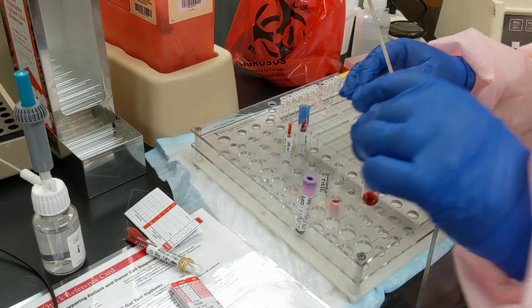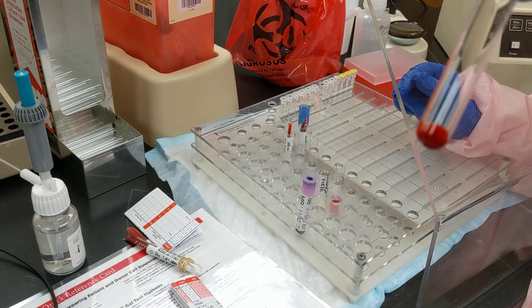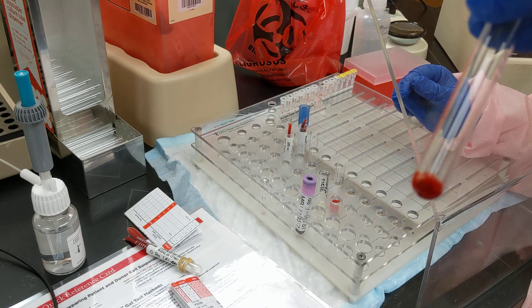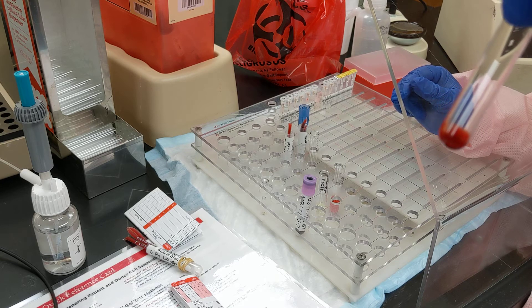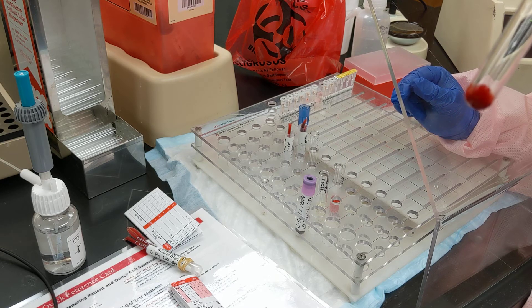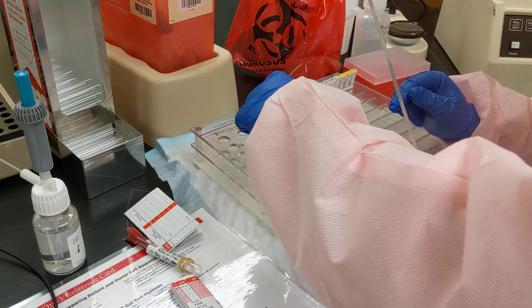Now you have nice packed red cells in your tube, which you can use to make 3–5% concentrations of cell suspension for crossmatching, or you can make 0.8% if you want to do a full crossmatch in gel.